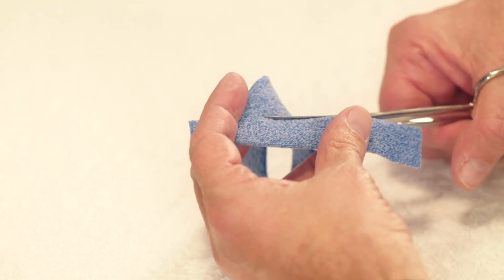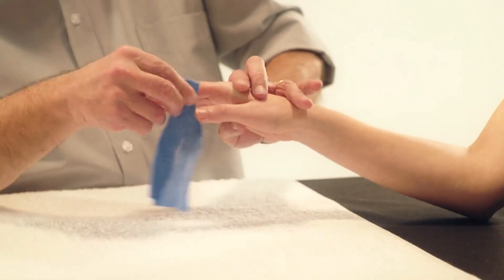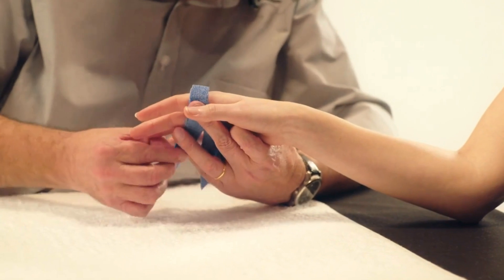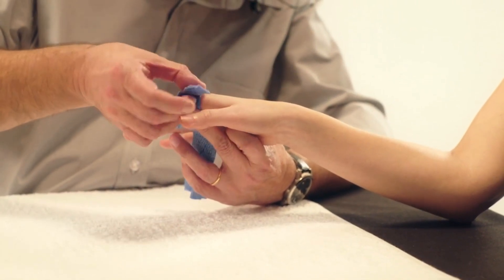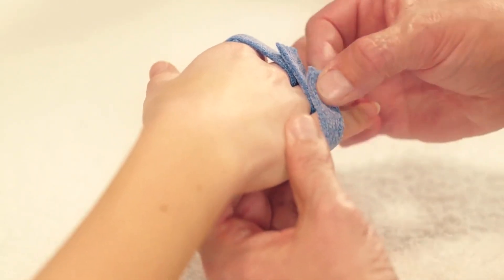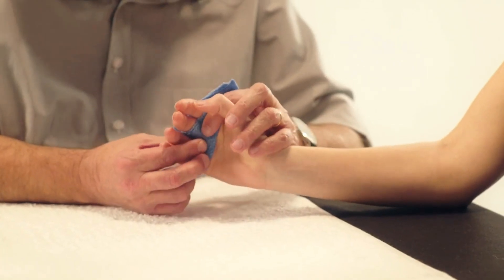Mould the piece on the palmar side of the hand. Pass the strips between the fingers and stick them together dorsally, forming loops around the proximal phalanges. Hold the fingers in the right position and mould the arches perfectly.